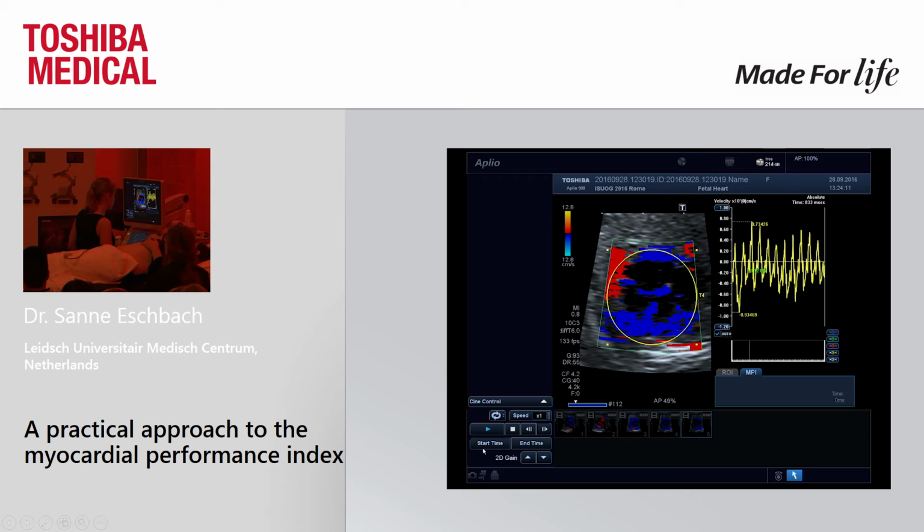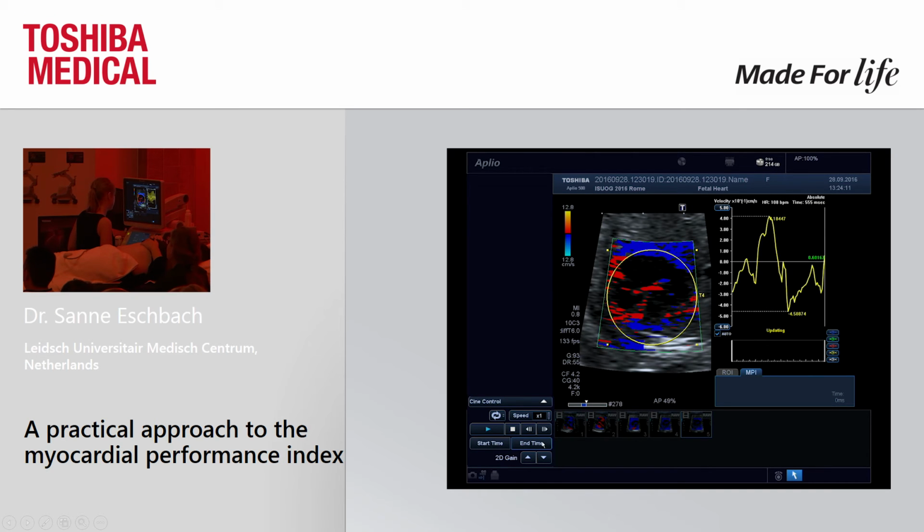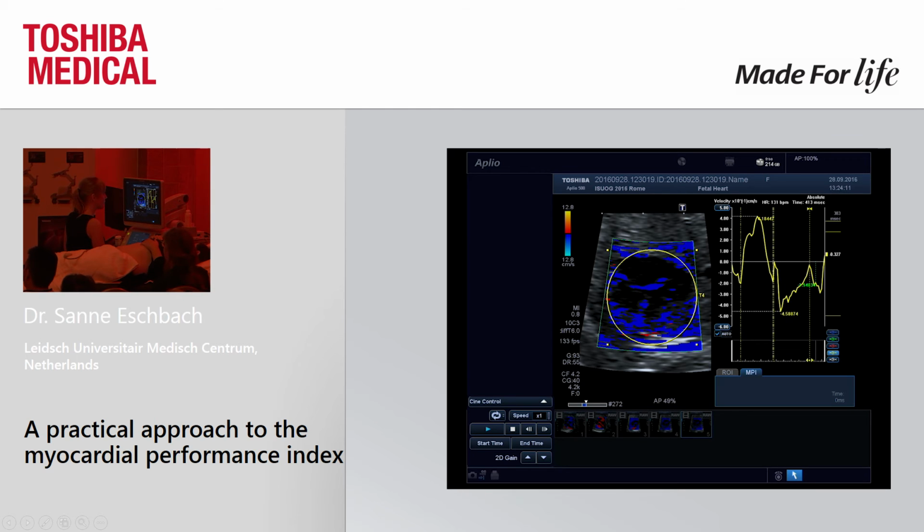So let's see, drifting a lot here. I'm just searching for a good cycle. For example, here you see the relaxation time and there the contraction time. So we can take this one if we want. Start time and here end time. Let me make it somewhat smaller to make it easier for us. Here you see the relaxation time clearly, and I can mark the beginning and the end, and here starts the contraction time, and there's the end of the contraction time.